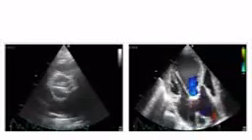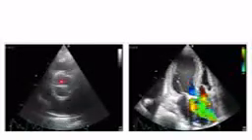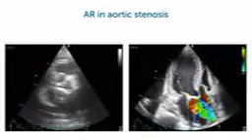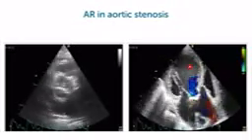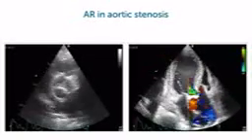And here we have another example. Look at this extremely calcified and thickened aortic valve, which causes AR, but the flow is in acceleration also during systole. So we can guess this is a combined disease of the aortic valve, so regurgitation plus stenosis. Wait, Anna, for a second. Let me just show you one other thing. Look at the ventricle here. Do you see how dilated the ventricle is? So we not only have aortic stenosis and regurgitation, but also poor left ventricular function. And I just want to mention that this patient also has a pleural effusion here. So you see, you can pick up a lot of things.